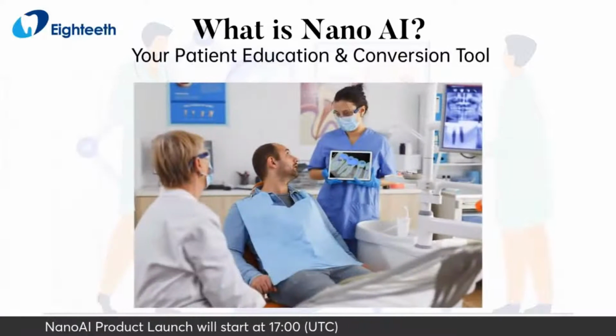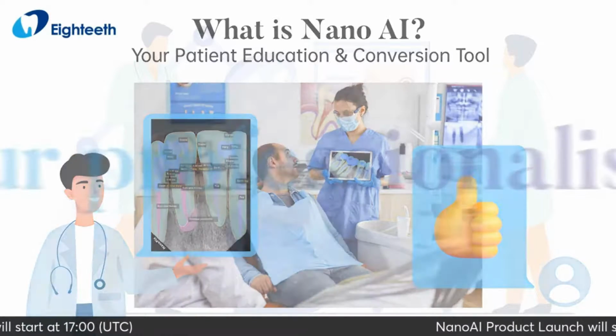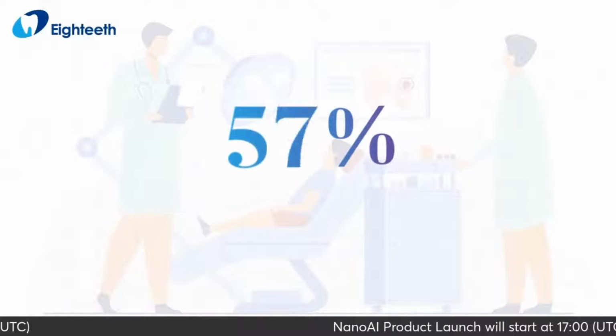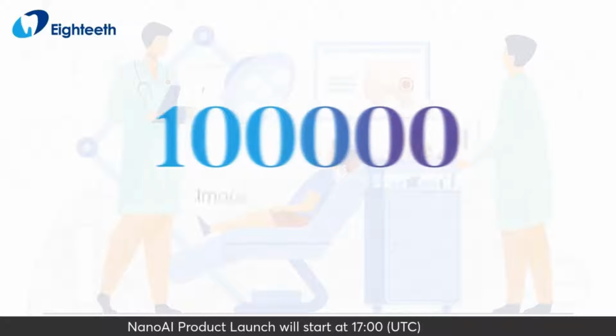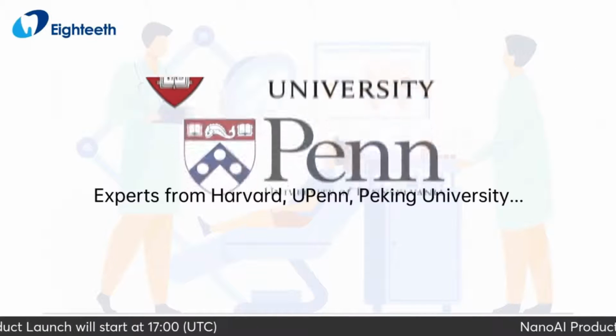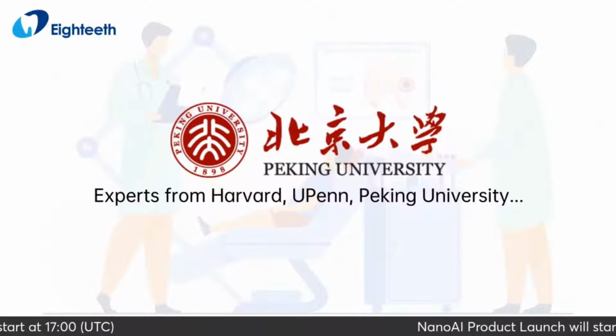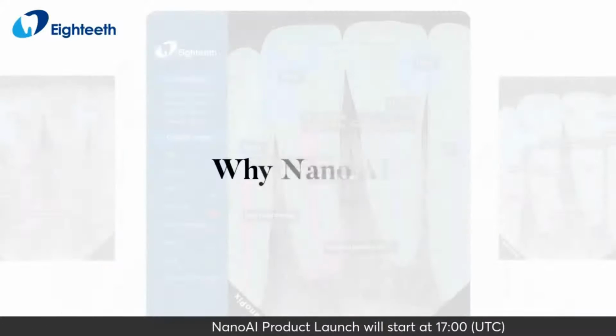It's also your patient education and conversion tool. Our professionalism: accuracy rate can be up to 93%. 1,000,000 images for model training. Experts from Harvard, UPenn, Peking University, more than 200. Why NanoAI?